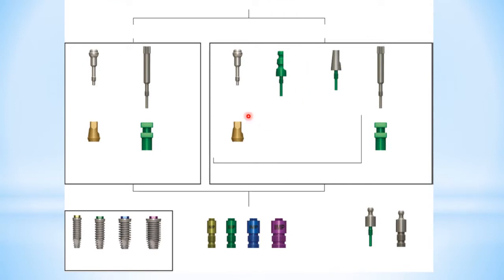Also here we can see different types of equipment that can be used for different methods of impression taking.